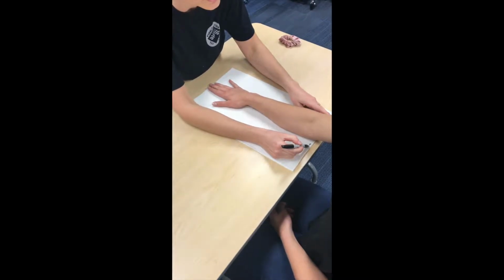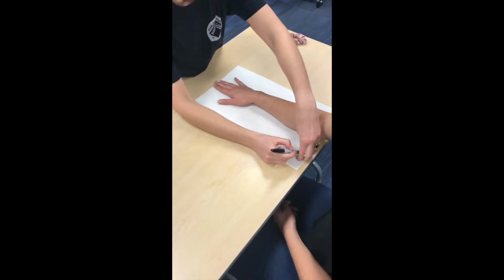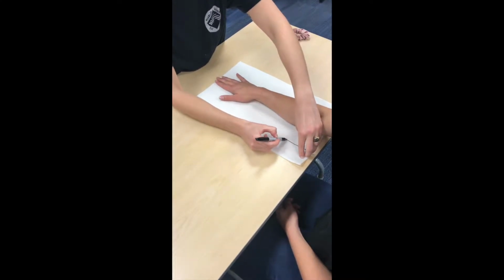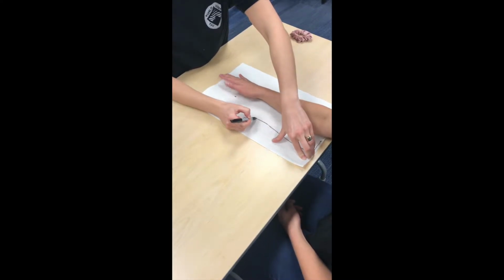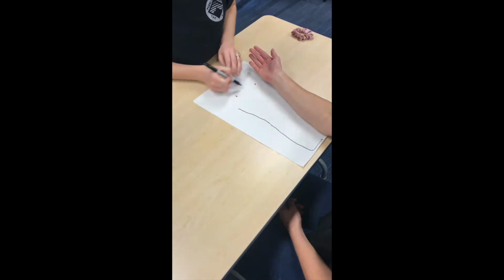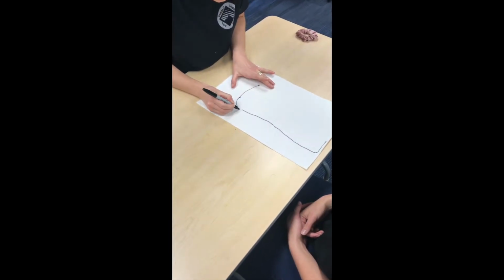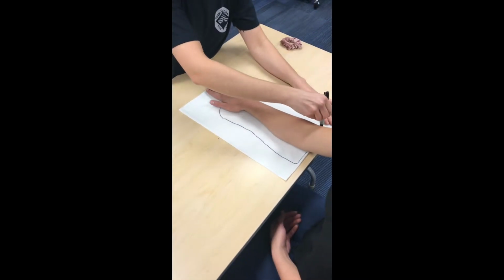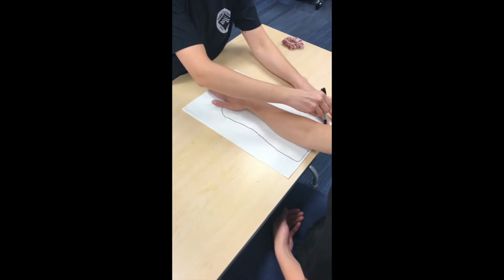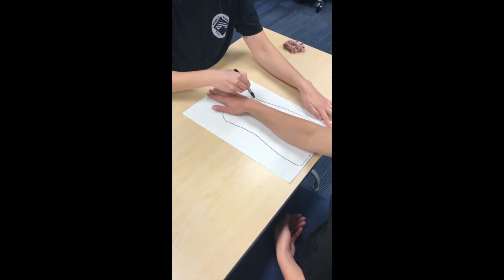And then go ahead from the marks you made, draw a line about 2 to 3 inches away from her arm, and then draw a line between those 2 dots, and then Kylie, go ahead and put your elbow right there again, just so I can make sure I give you enough material to wrap around that forearm.